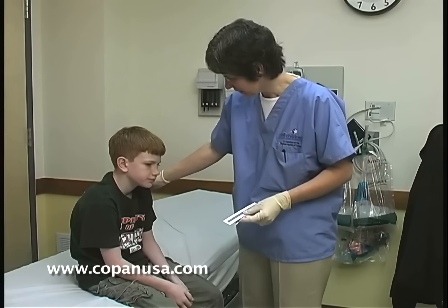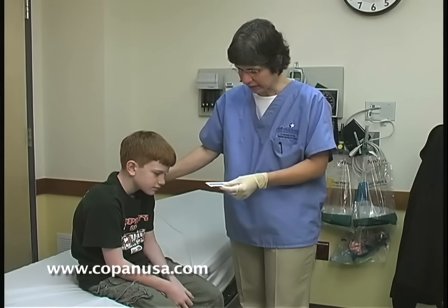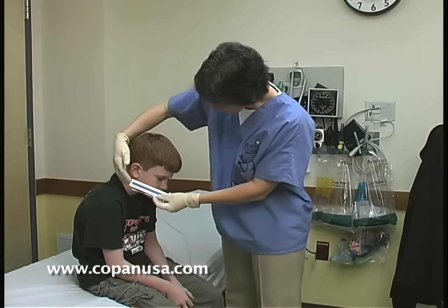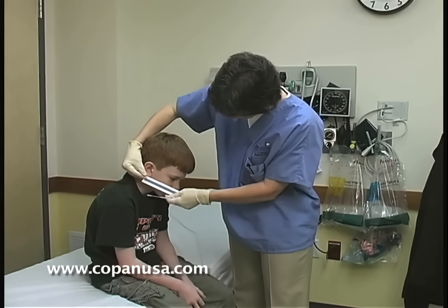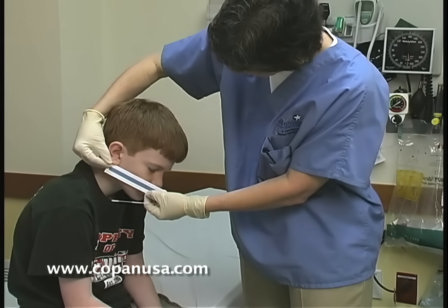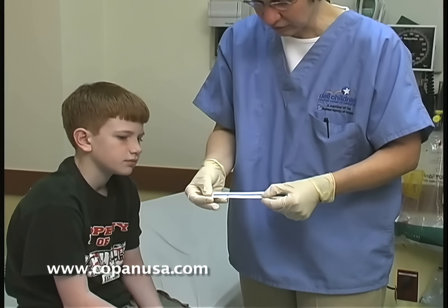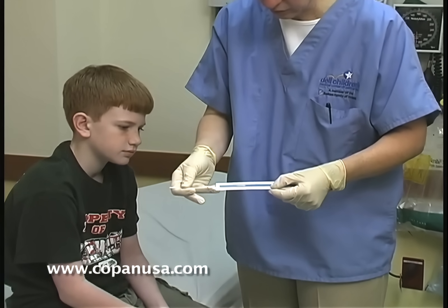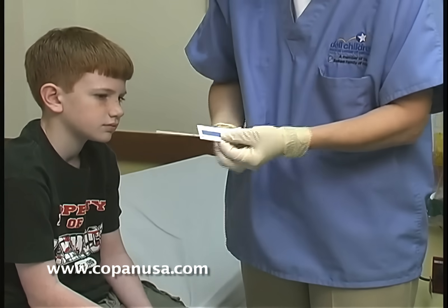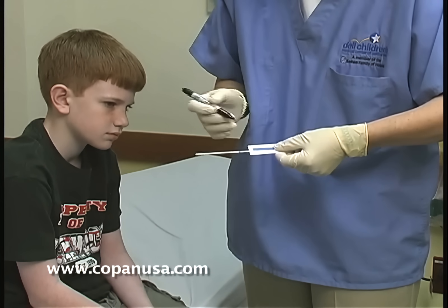This is Steven, and he's not feeling too well today. We're going to get a nasopharyngeal swab sample and test him for flu. As you've noticed, when we do NP swabs, we need to measure from the earlobe to the skin at the base of the nose. In this case, that's just under four inches. So we would take our swab and go about half that distance — a little less than two inches on Steven. You can take a marker such as a Sharpie and mark the depth of insertion on your swab so that you know exactly how far to go.